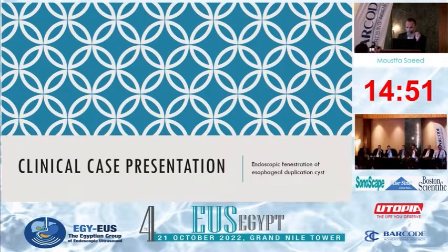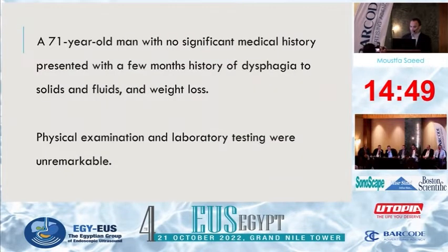This is a 71-year-old man with no significant medical history, presented with a few months history of dysphagia to both solids and fluids and weight loss. Physical examination of the patient and laboratory investigations were unremarkable.